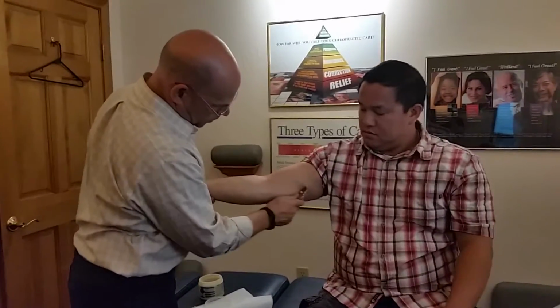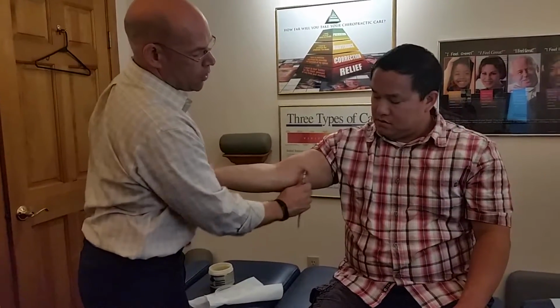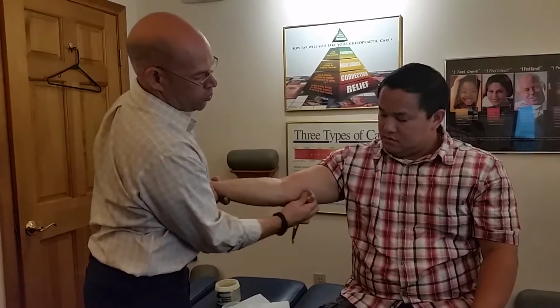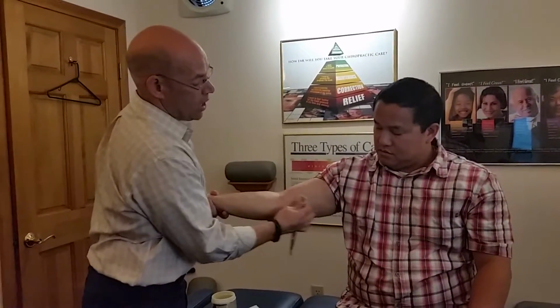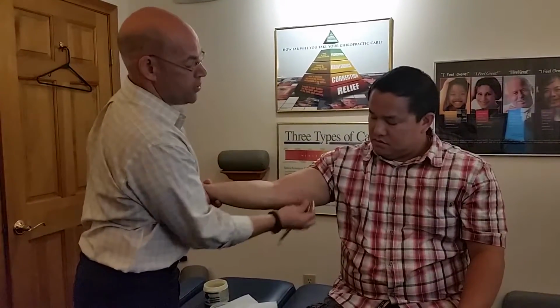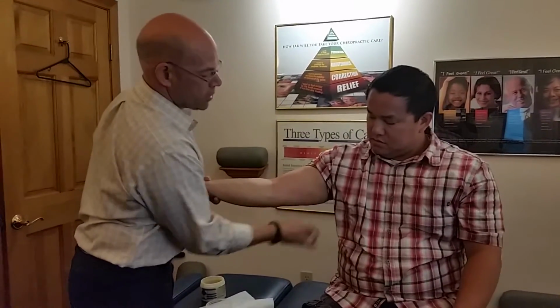So what we do with this tool, we break up adhesions. It helps to reorient muscle fibers and soft tissue in the proper direction. Inflammation usually creates haphazard orientation of fibers, crisscrossed, and creates adhesions around nerves, as in this case, or ligaments or tendons. And every time you move it, it creates extra irritation. So that's all we're doing. Do it in different directions, back and forth.